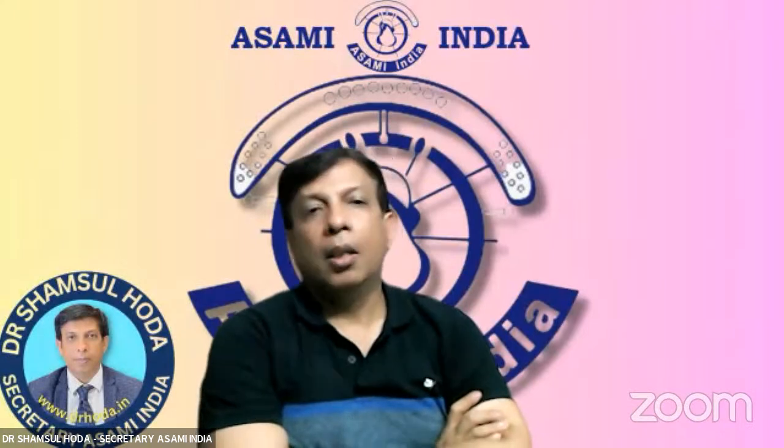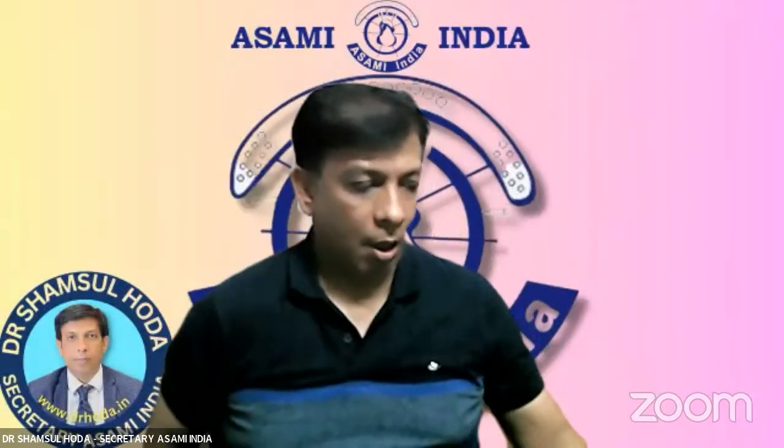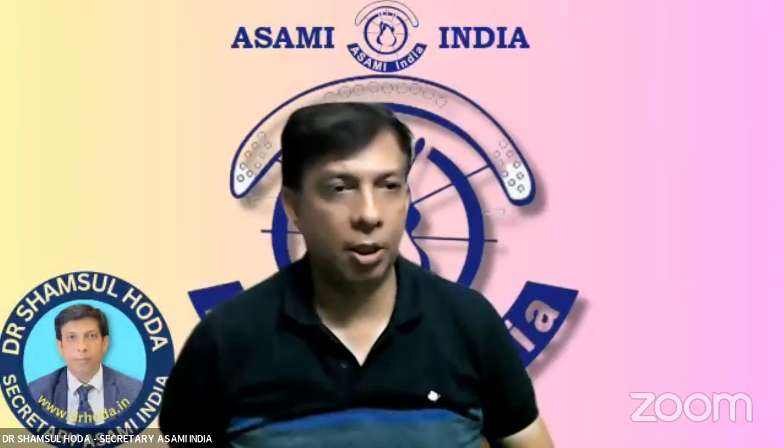What is the average duration of the rings, sir? How many months do you keep the rings on in an average case? Roughly 6 to 8, 9 months. I want to add, after removal of the frame, I give the patient a brace, a humerus FCB type, with a metallic stud on the lateral aspect, tied medially. It is so well contoured that even if the patient falls or does some rotatory movements, it will not refracture. Even if it is a very solid union and I am confirmed about the union, I still give that. To ensure, yes, that is a vital point, sir. It's very important for the youngsters.